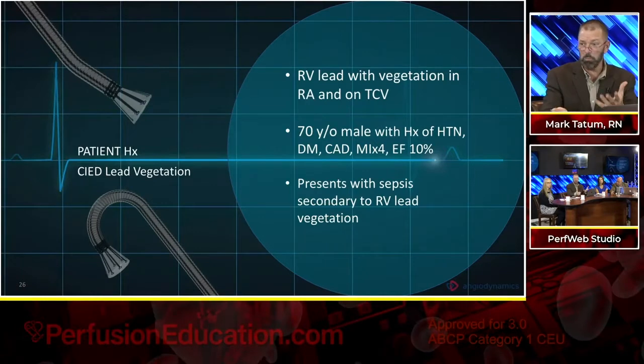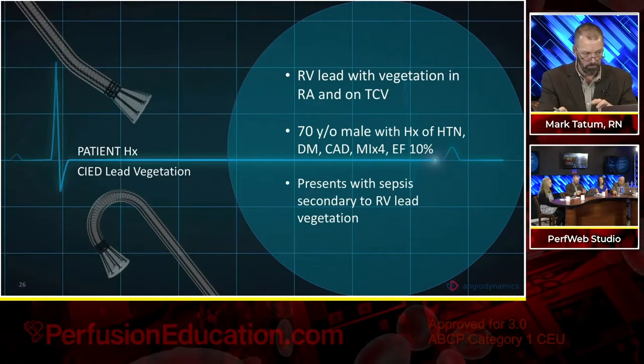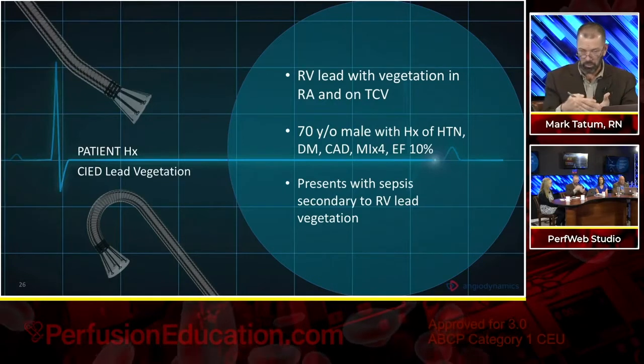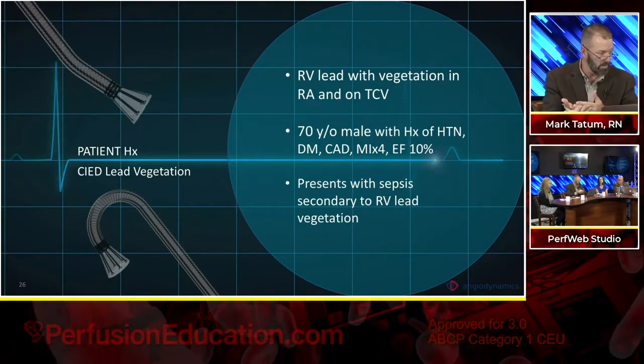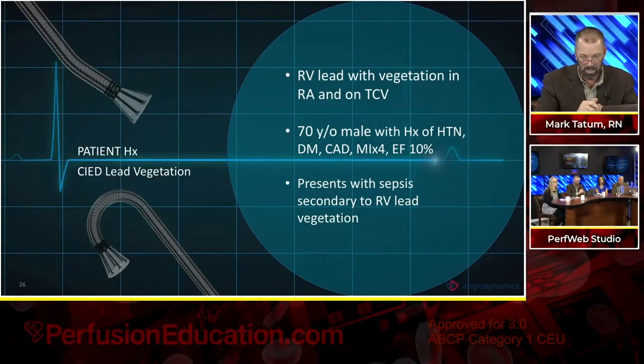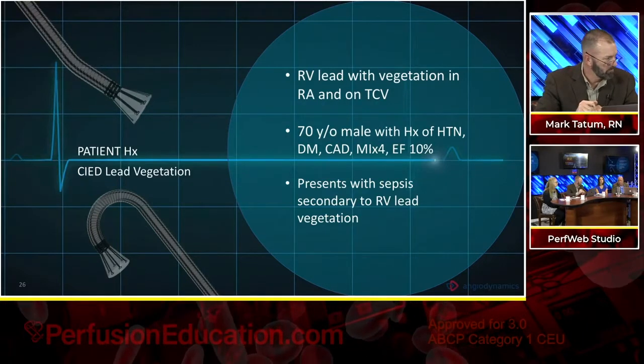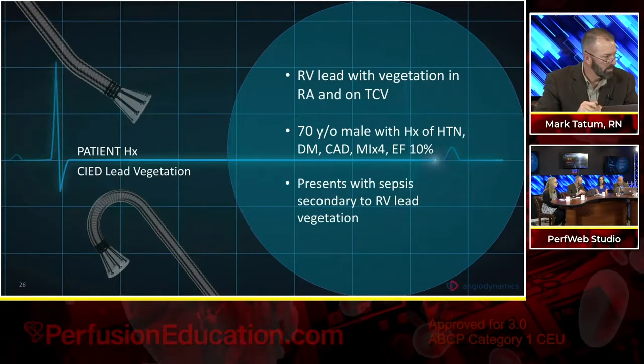We are a flow-mediated device. We have to have flow in order for this thing to work. And to the degree that the patients will tolerate it, we want as much fluid on board as they can maintain inside the vasculature without causing any kind of issue. Well, that's a worthwhile point. Somebody with an EF of 10% is going to be very volume overloaded.